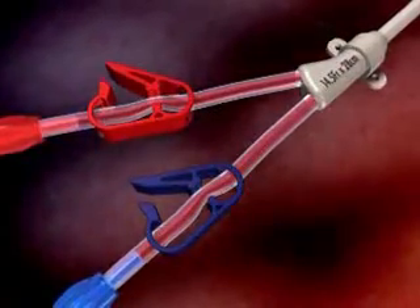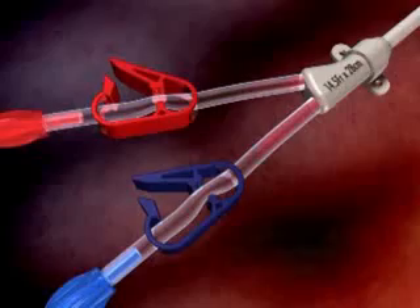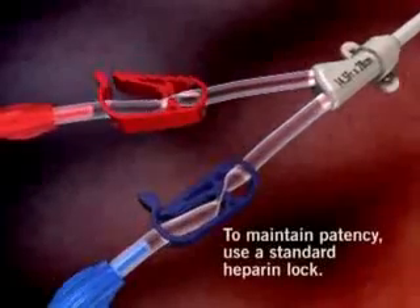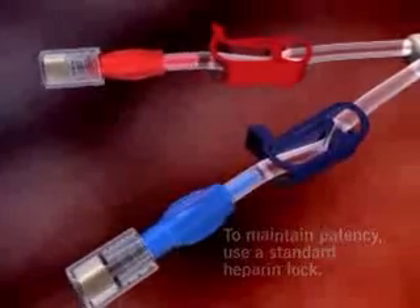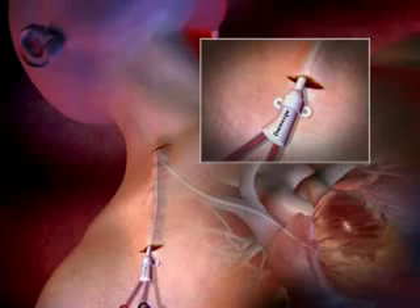Both lumens should then be flushed with saline-filled syringes. Close the extension clamps, remove the syringes, and place an injection cap on each luer lock connector. Confirm proper tip placement with fluoroscopy. Suture to secure the catheter hub to the chest wall.